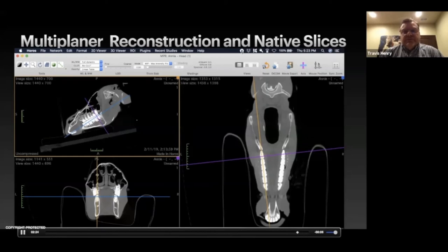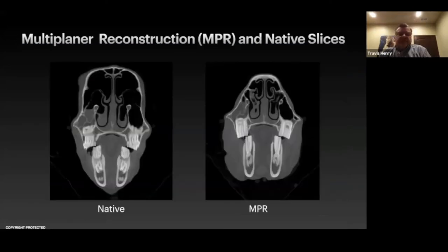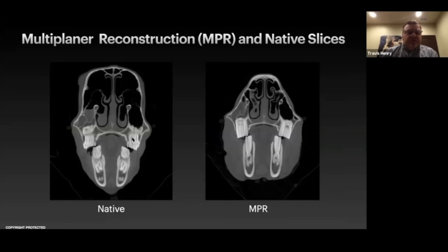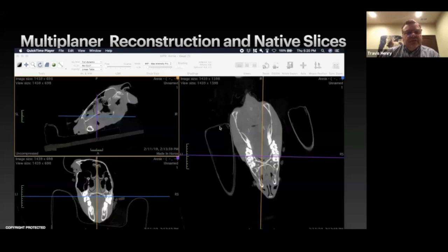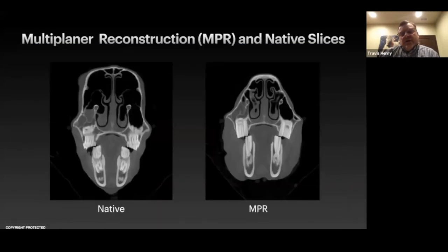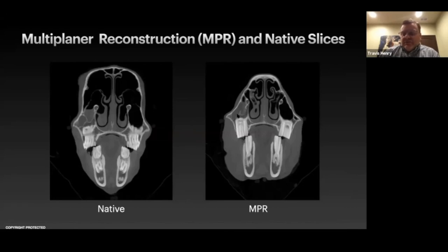This is a really powerful feature of CT. When the native DICOM images come from the unit and you just scroll through them, you can see only part of the occlusal surface of one tooth and the apex of another — that's simply how the horse's head was positioned. If the head angles down, the CT clips part of one tooth and part of the next. But with MPR correction, we can look at each tooth individually and compare right and left. Hopefully there's a normal tooth on one side and an abnormal on the other — and here you can easily see the problem with sinusitis involved. That's how powerful CT can be for examining individual structures in all different planes.